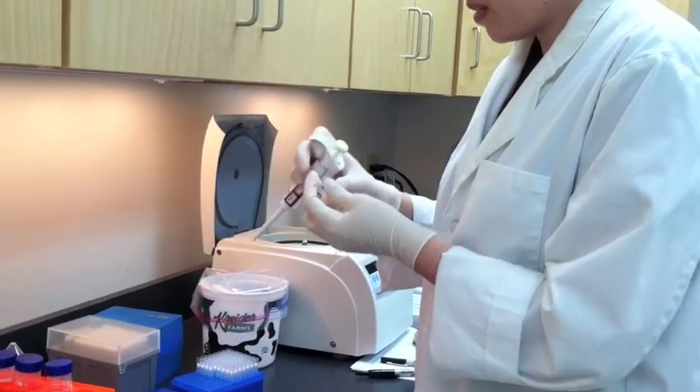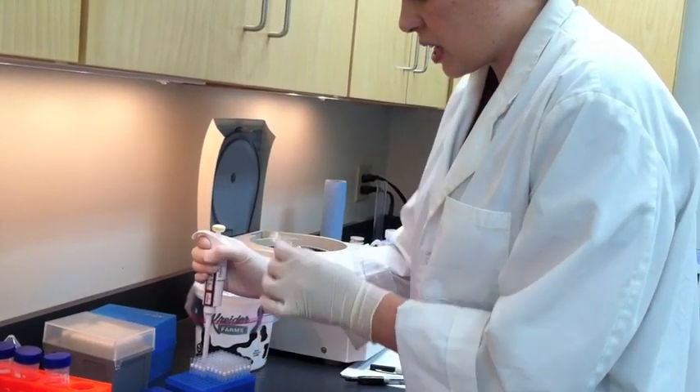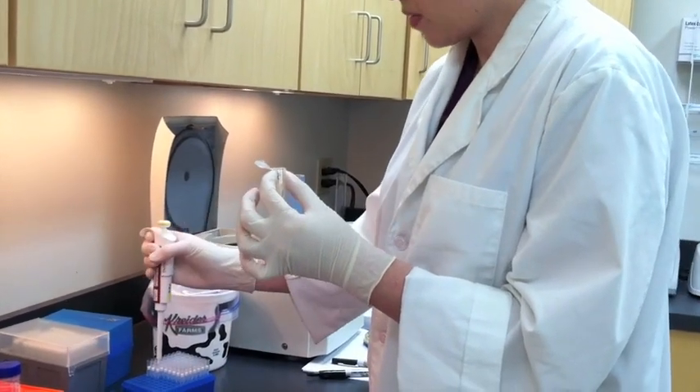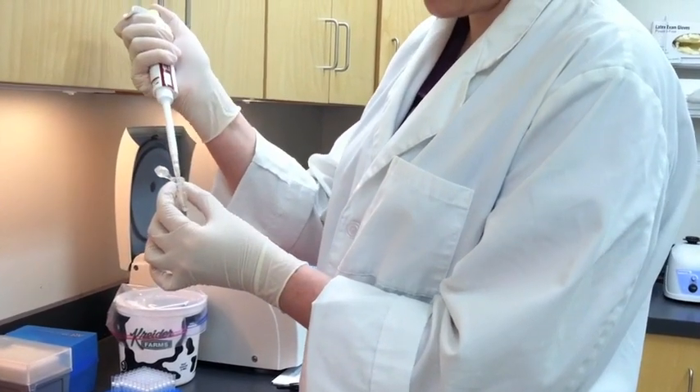The size of the pellet varies depending on the sample and how much bacteria is in it. Sometimes there will also be a layer of fat on top of the bacterial pellet. It just depends on the individual sample.